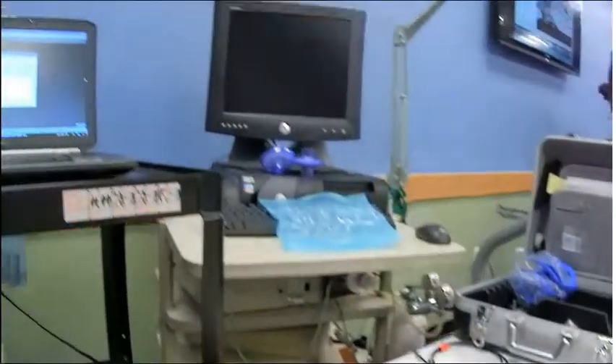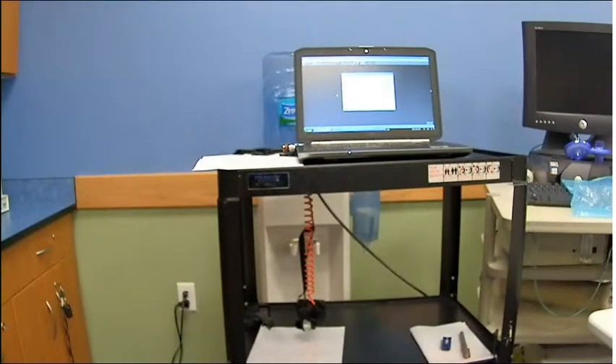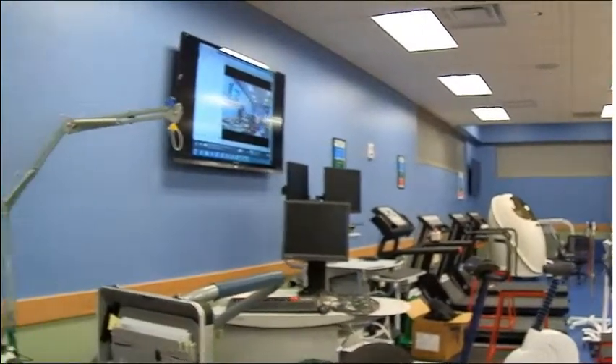Over here at this station is the laptop that I installed the K4 software onto. This is where it can be found, right behind the AlterG.